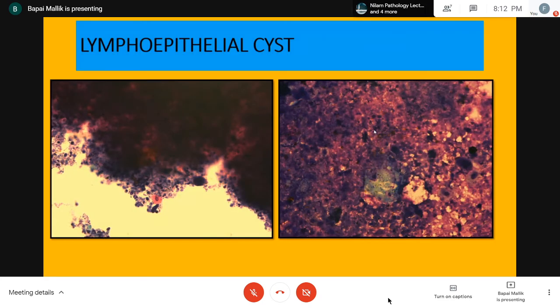Now, this is a very tricky lesion, because if this particular slide comes under my microscope, I just look at this dirty material. I might just pass it off as some kind of acellular material, maybe coming from a pseudocyst, I don't know. And whenever you see this dirty material from a pancreatic cyst, you should look very, very carefully for the presence of ghosts of squamous cells.